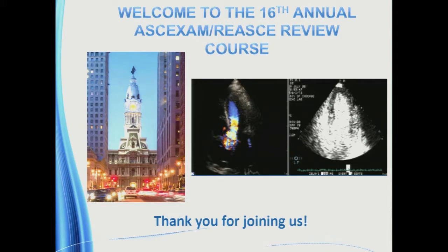Then there's a question of the value of RV strain, and whether RV strain will be on the boards. Dr. Rudsky made a comment at the end about RV strain in the last lecture, talking about some of the limitations of normal values. If there's a question about right ventricular strain, remember this: it is the 3 segments of the RV free wall, so it doesn't include the septum. They're just looking at the basal, mid, and apical segments of the RV free wall, and a value more negative than minus 20% would be considered normal. Same value as has been recommended for the LV.